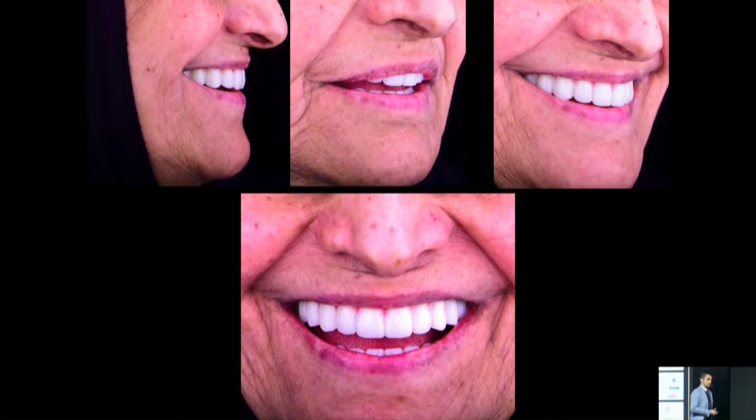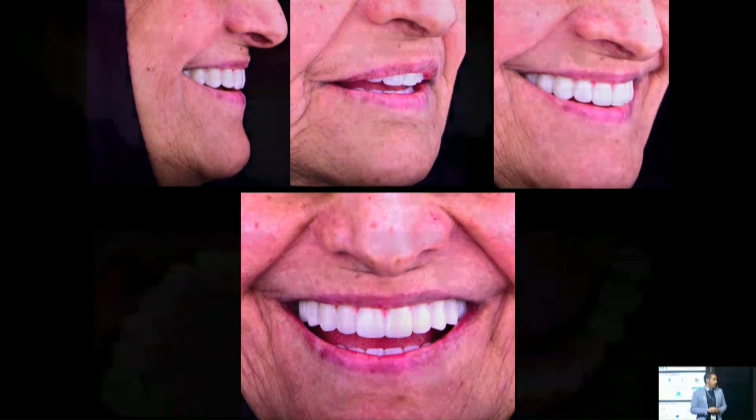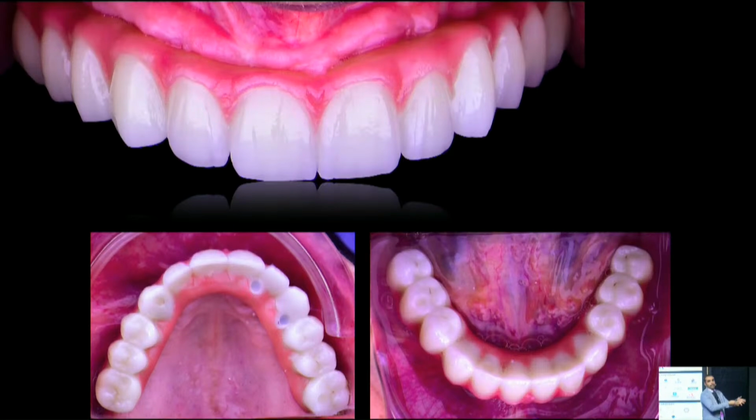After that, I go ahead and mill, in this case, a polymethyl methacrylate temporary, deliver it to the patients, and I typically have them function with it for a couple of months before they come back for the final. Now, if you do your job well with the try-in, you don't get much feedback from the patients. Typically, patients are very happy with it. Keep in mind that they were already completely denture-wearing, so those are the patients that would be happy with the least, to be honest. After that, we can simply replicate the design that we used for our temporary into our final product. In this case, it's a zirconia-based framework.